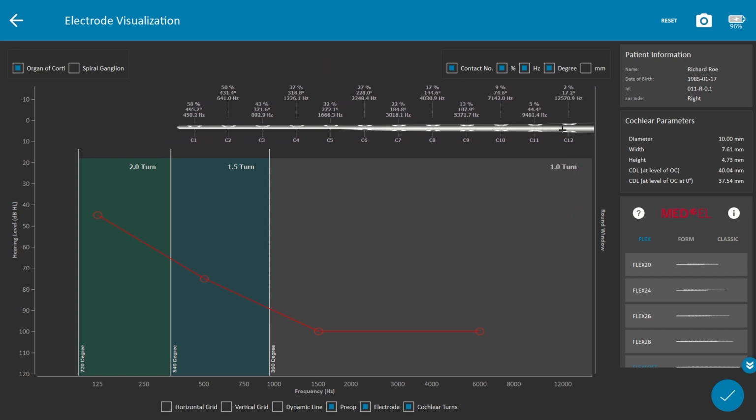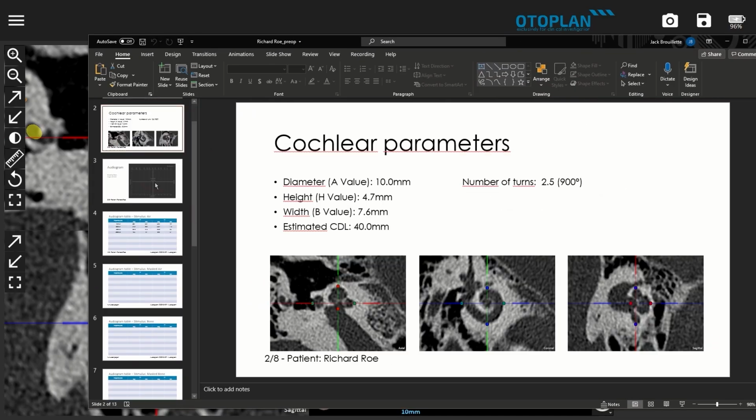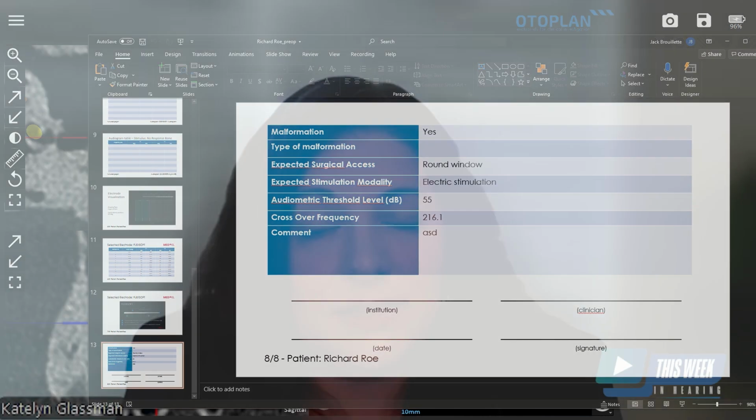Post-operatively, it's really variable if the center is already getting scans. So centers are having to determine when they're going to have that scanning process. We've seen success with centers getting images on the day of surgery. Some are doing it at the surgical follow-up visit. Some are doing it on the day of activation and some after that point. So it's really about what works best in their clinical workflow. But I think that's the biggest hurdle. Once we get through those first pieces of logistics, then most centers are using OTOPLAN on demand services and continuing to use those services for their patients.